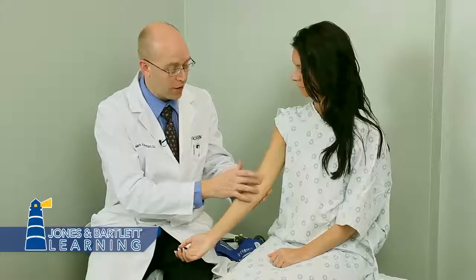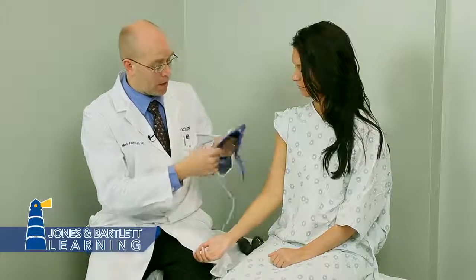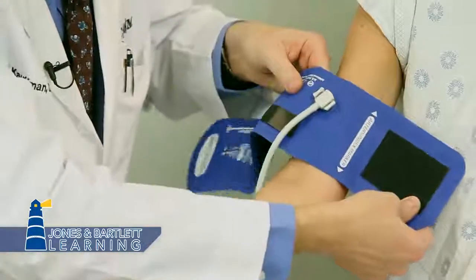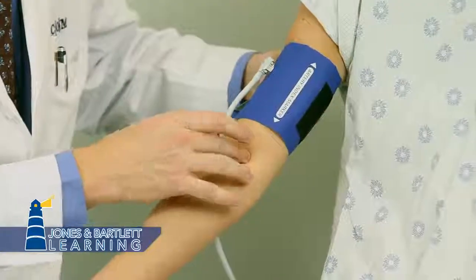So once you've found the artery, now you know it's there, you don't have to hold it, you understand where it's at. Pick up your cuff, and this is the artery marker. It tells you exactly where to put it. So don't put it over here, that's not where the artery was. Bring it over to the center, placing it medial to the bicep tendon, that's where we found it.